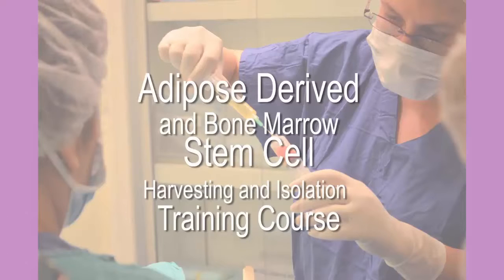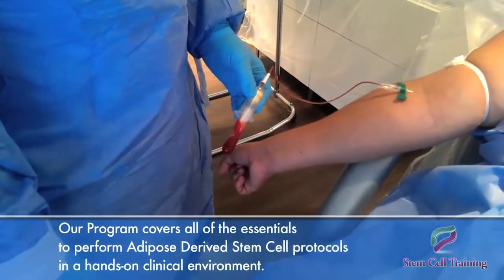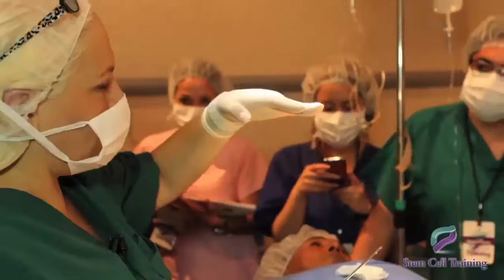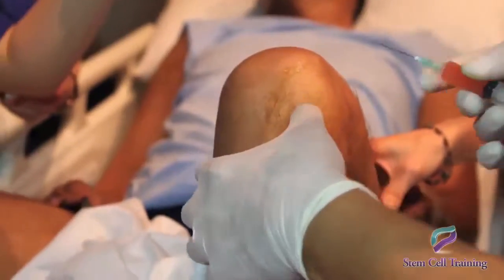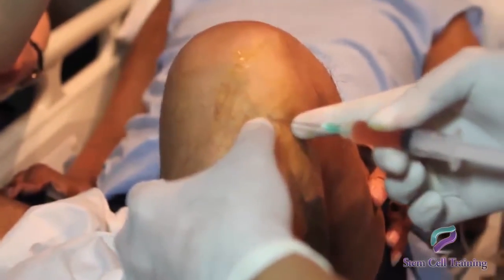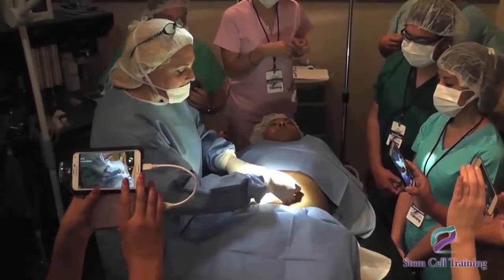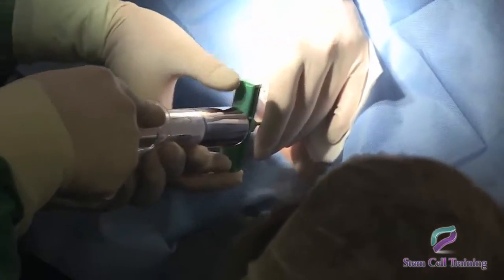Adipose-derived and bone marrow stem cell harvesting and isolation training course. Our program covers all of the essentials to perform adipose-derived stem cell protocols in a hands-on clinical environment. These courses are designed to provide personalized instruction and to enable physicians to easily transfer essential techniques to their practices. You will receive hands-on training on the extraction of lipoaspirate and bone marrow aspirate.